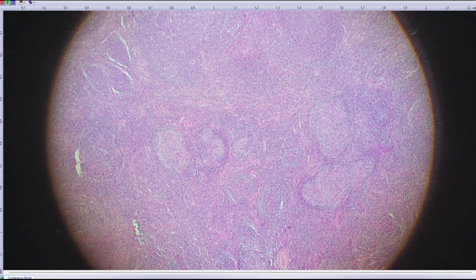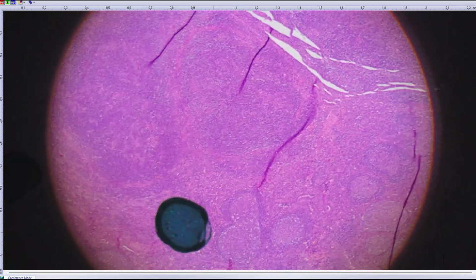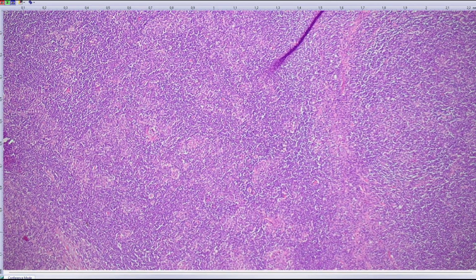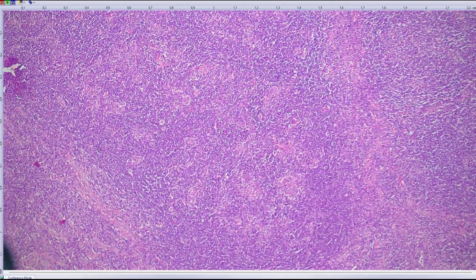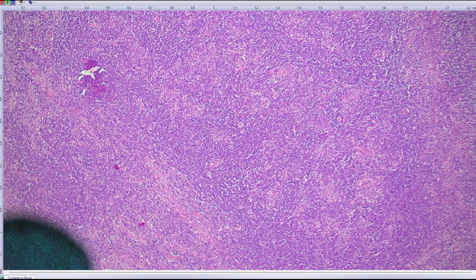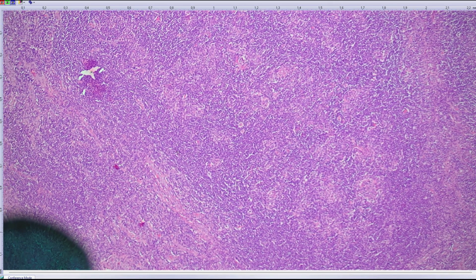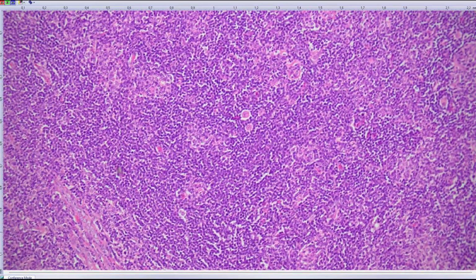And this case is quite easy because this guy actually has a history of the same. It's the nodular lymphocyte predominant B-cell lymphoma, previously called nodular lymphocyte predominant Hodgkin lymphoma, but the cells actually don't have very much in common with normal Hodgkin lymphoma, so now it should be called B-cell lymphoma.